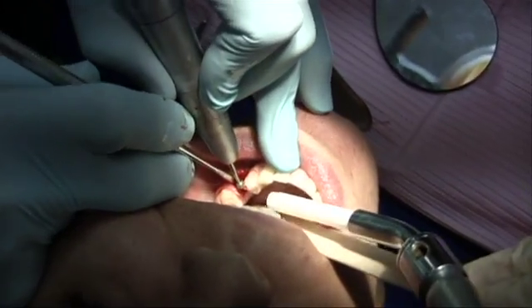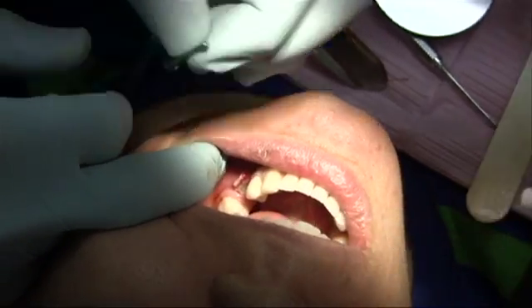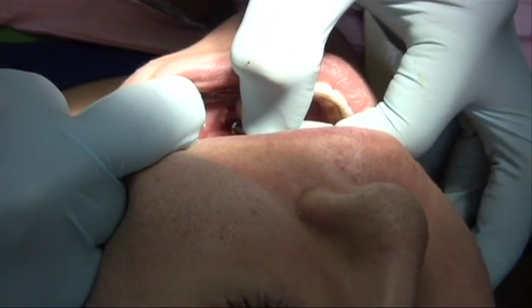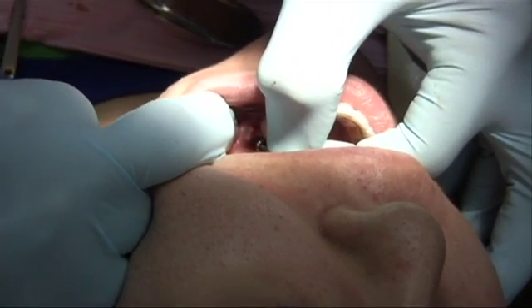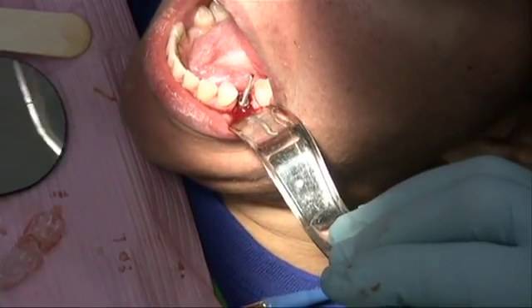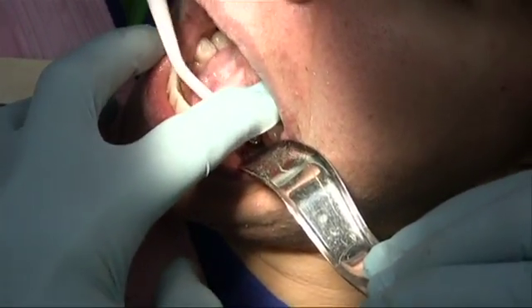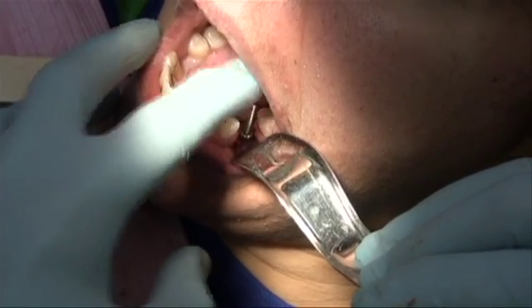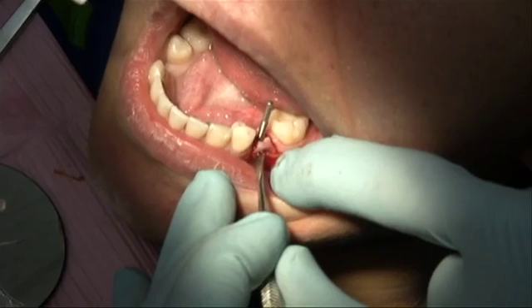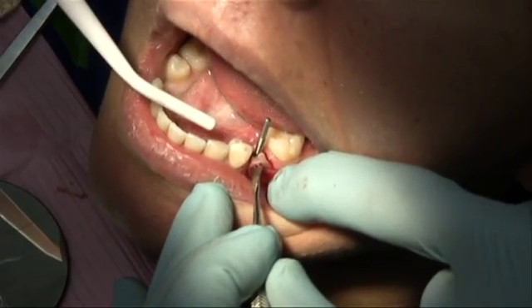When the ridge is modified to allow proper vertical position of the platform, the osteotomy is prepared to the desired depth for the implant length. The platform will then be positioned in the desired vertical position. Here you can see the ideal three-dimensional position of the platform of the implant, which will allow fabrication of an aesthetic restoration. With the use of the Verbin Depth Gauge, proper three-dimensional placement of the implant platform will be easy to produce on a consistent basis.